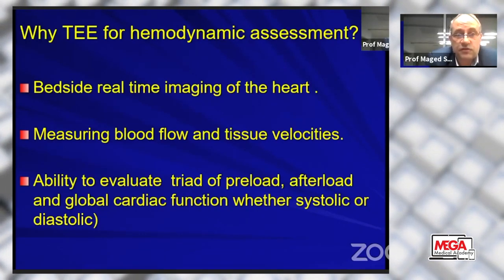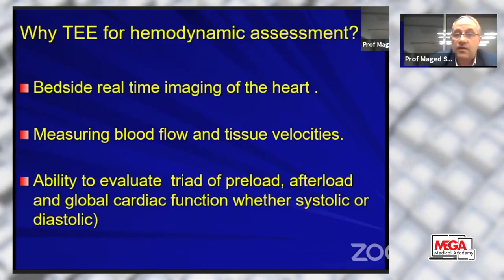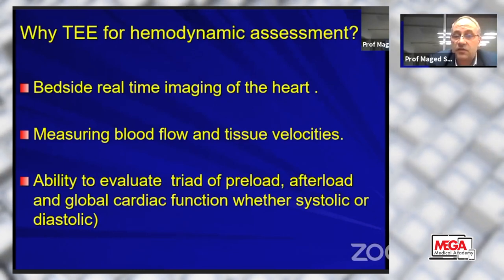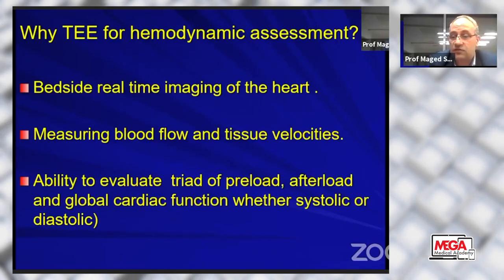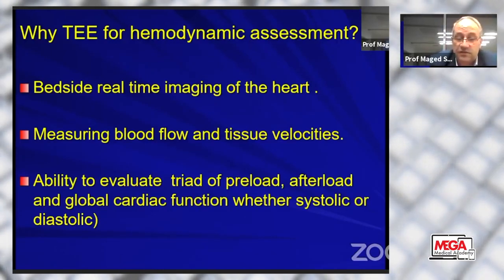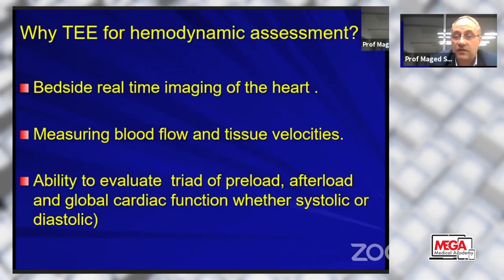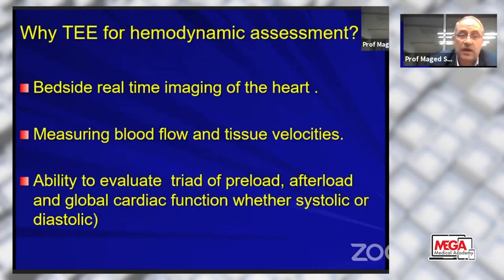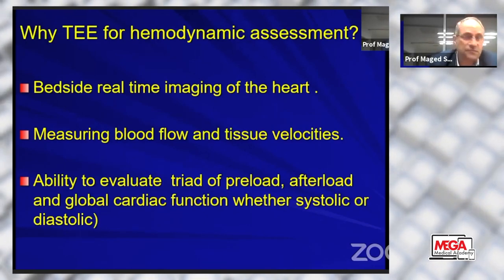Both transthoracic and transoesophageal offer bedside real-time imaging of the heart. They measure blood flow and tissue velocities. They are able to evaluate the triad of preload, afterload and global cardiac function, whether systolic or diastolic. So this makes it a unique method of monitoring the patient and diagnosing hypovolemia, hypocontractility and other pathologies.